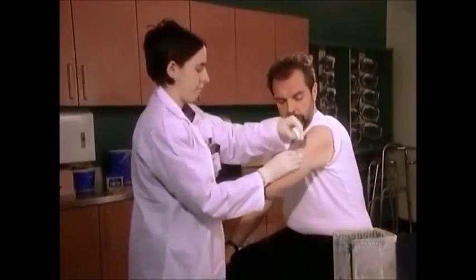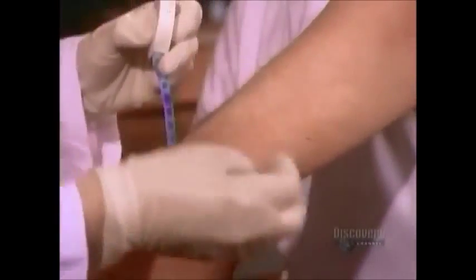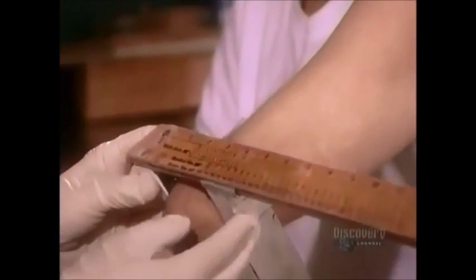They start by measuring the amputee's stump, what doctors call the residual limb. First, they measure the circumference at different points, then the diameter at different points.